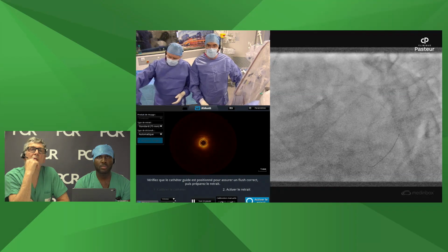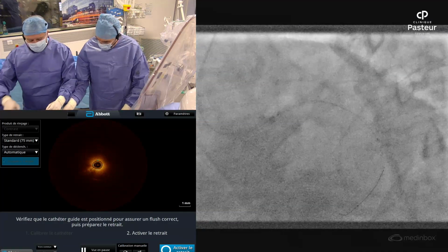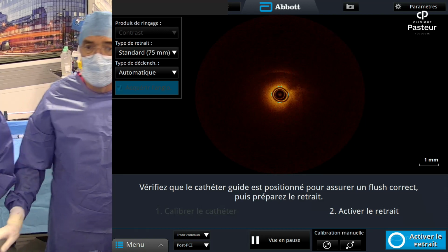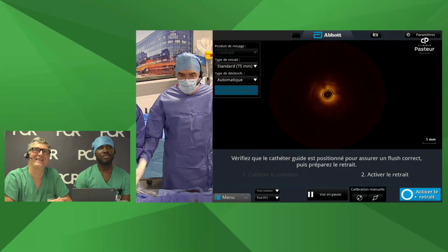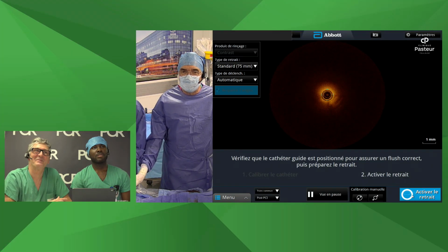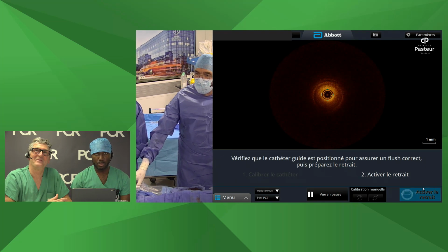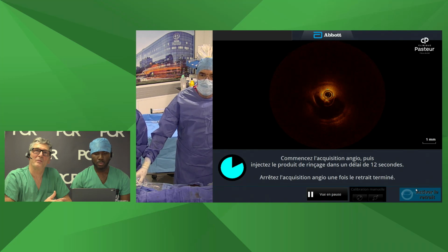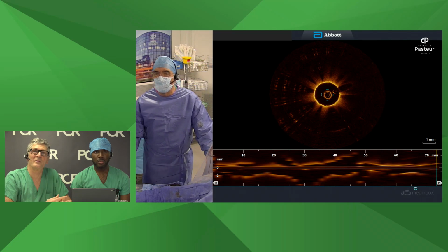Let's try. It will be a manual injection, so I'm not sure that I will achieve the same quality. But you are strong enough to do it. I'm working with Bruno, he has the power of the injector. Are you ready? I'm ready. Activate the pullback, okay? Excellent. Very good.